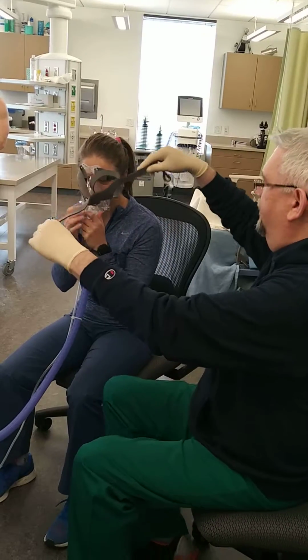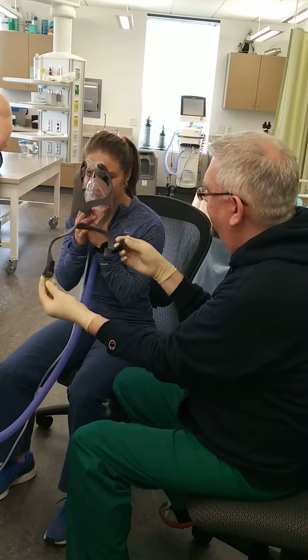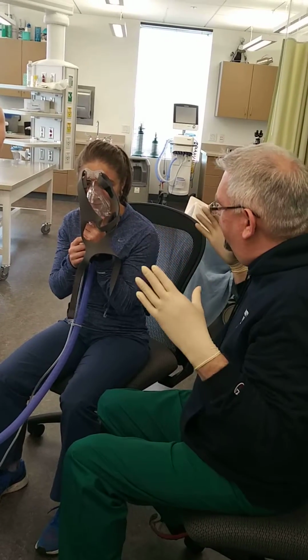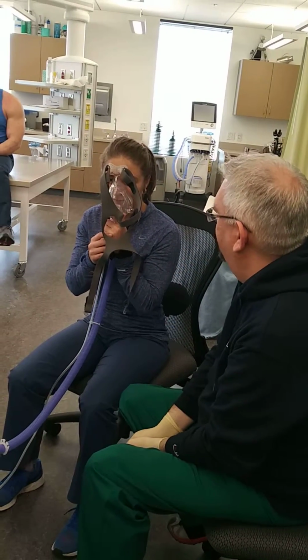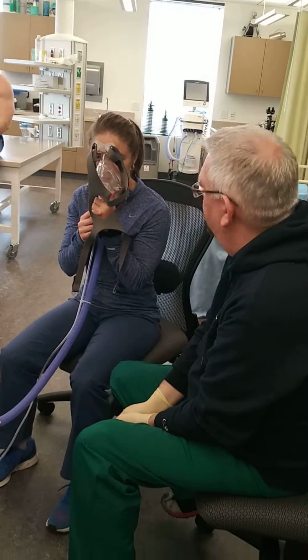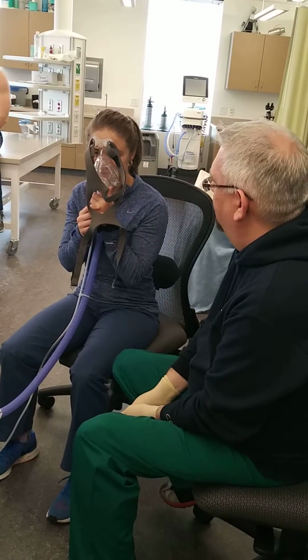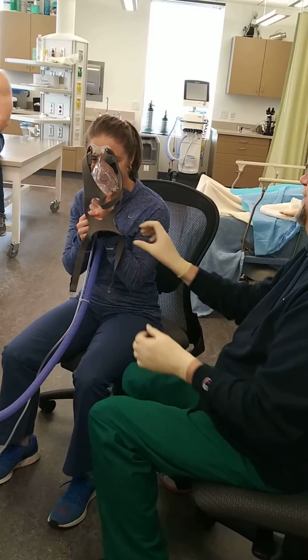These straps here go around the back of your head, and then they clip in, and we're going to make some adjustments to make sure that it fits fairly securely, but I'll also show you how to take it off if you need to, okay? I don't want you to feel like you're trapped in there, okay? Doing okay? Mm-hmm. Okay? All right, well, let's try this.